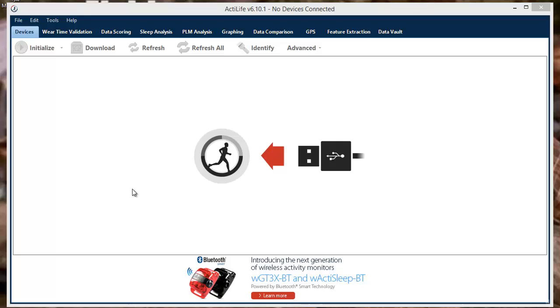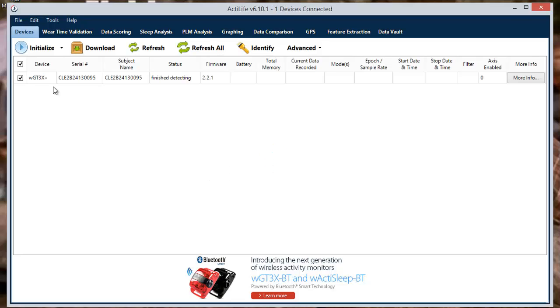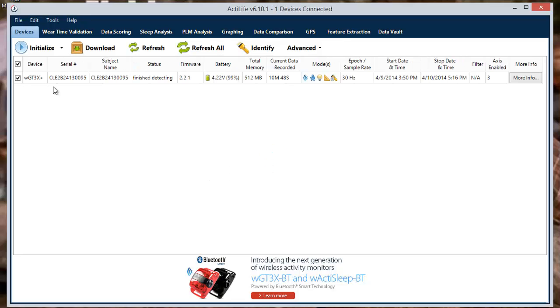Let's begin by opening the ActiLife software and choosing the Devices tab. Once the Device tab is brought up, your ActiGraph devices can be plugged in using your USB cable. ActiLife will then recognize the device and the device's information will appear on the screen. The checkbox to the left of the device should then be marked.